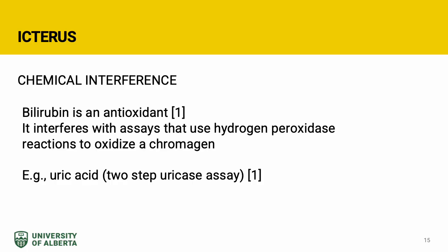produced. As with hemolysis, it's important to note that although bilirubin may cause negative interference in hydrogen peroxide reactions, if there is spectral overlap between bilirubin and the measured oxidized chromogen, the net interference may be positive.